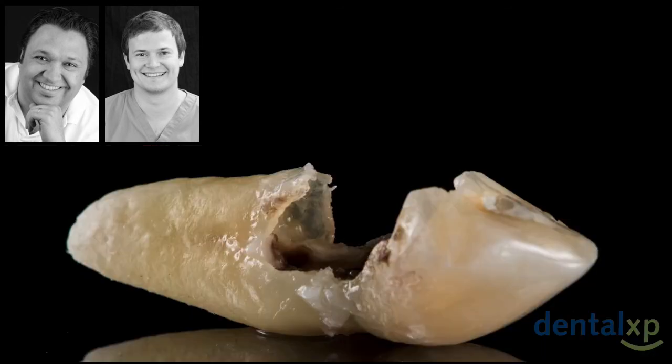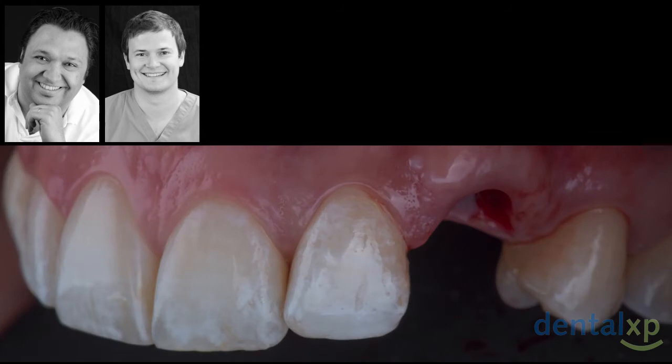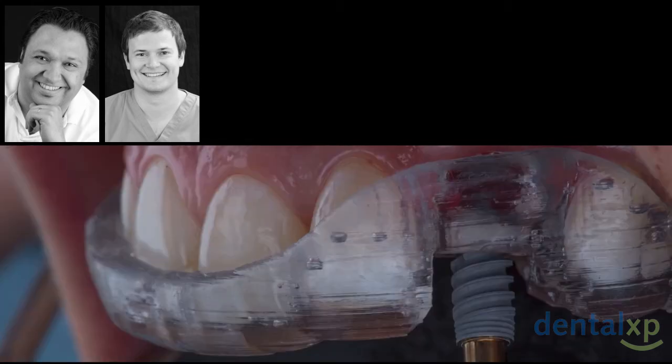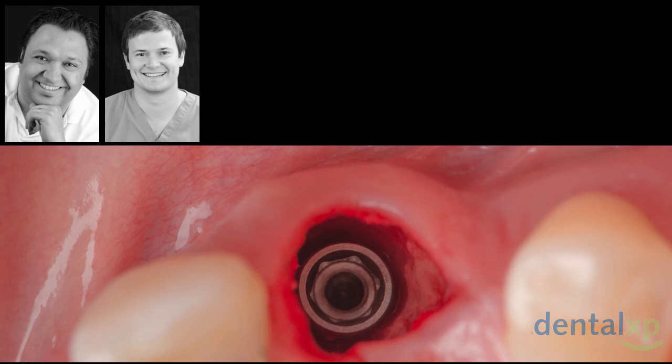In this case, we just remove the tooth, and as you can see, a very localized lesion in the palatal, a very big lesion, but still we are able to remove the tooth atraumatically, and this is very important to preserve all the structures around. No flap in this case. And here we go with the surgery. We use the surgical guide, do our drilling, and place our Nobel Active implant, very important here to obtain good primary stability with a very small amount of bone. You can see here occlusally the position of our implant. We have a gap buccally that we're going to fill with a xenograft according to the dual zone technique. You will see that later.